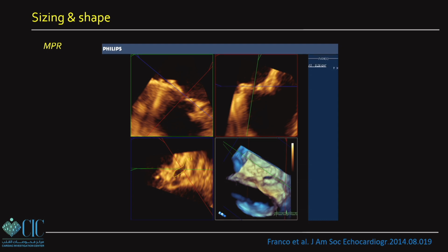What does it mean? If you see this paper, Dr. Abdul Halim Kinsara sees this paper with certain dimensions because he's just right in front of it. He sees the height and the width. From this side, I'm sure you will see the height the same as Dr. Abdul Halim, but the width is less because he is facing that. So if I tilted this paper, although it is the same dimensions, the projection of this paper in your eyes will change the dimensions. Now the vertical dimension has become less, right? And now the transverse dimension has become less.